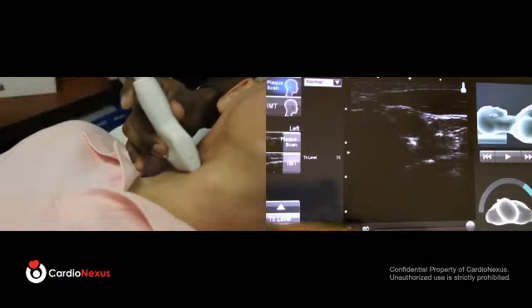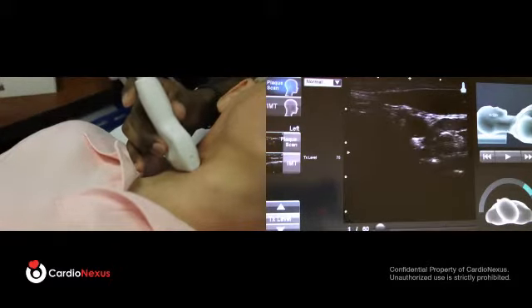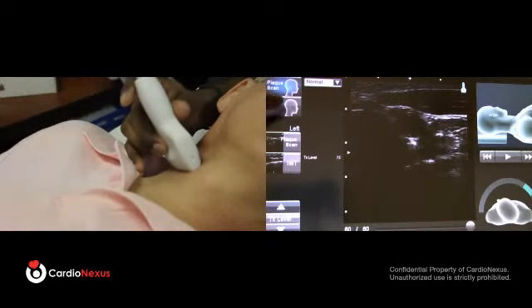From here, you have the option to go back through 60 frames of a video loop and pick a better image if you did identify one. In this case, the last picture that I've taken is sufficient, so I will now choose the IMT measuring toolkit.